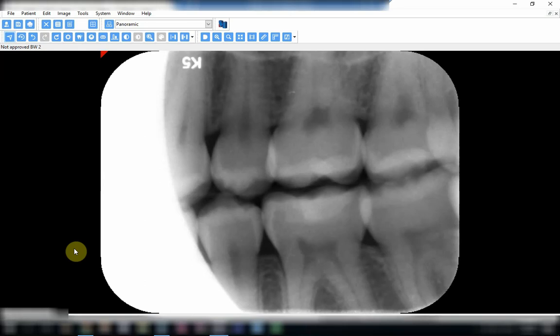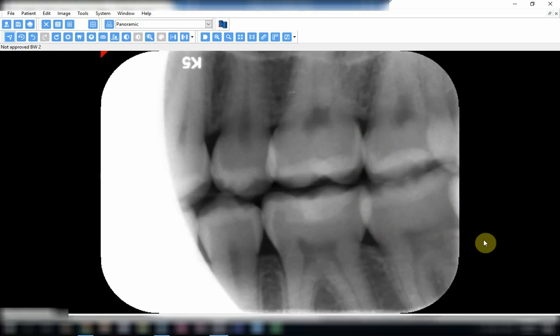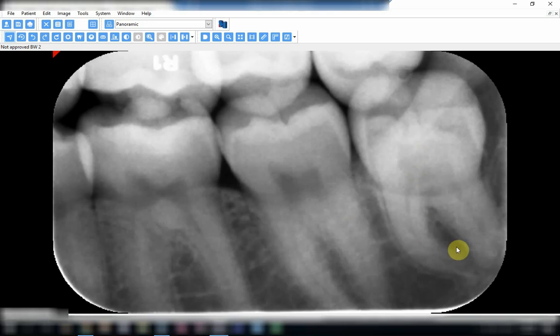The second mistake is the incorrect horizontal angulation. If you see this area, you can see overlapping margins of the teeth one over the other. In some areas it's almost okay, but in other areas it is completely inaccurate — there is clear overlapping of margins. This results from the incorrect horizontal angulation; the cone was not oriented properly so the x-ray would pass in between the teeth.